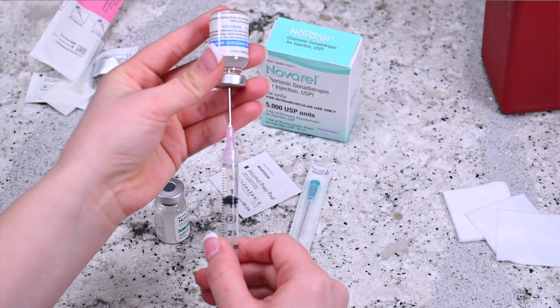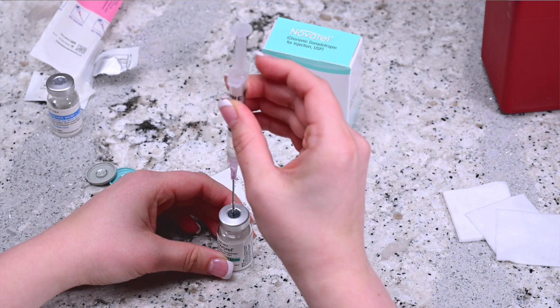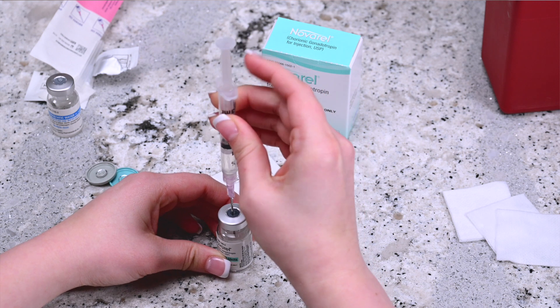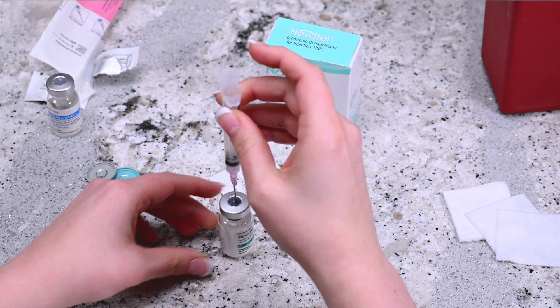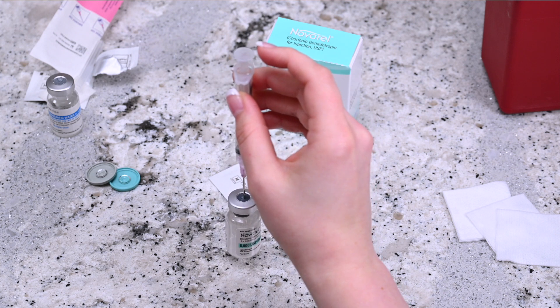Remove the needle from the vial and place it into the vial of Navarrel powder, and release the solvent by pushing the plunger. Mix the contents of the vial by gently swirling the vial until all the powder has been dissolved.